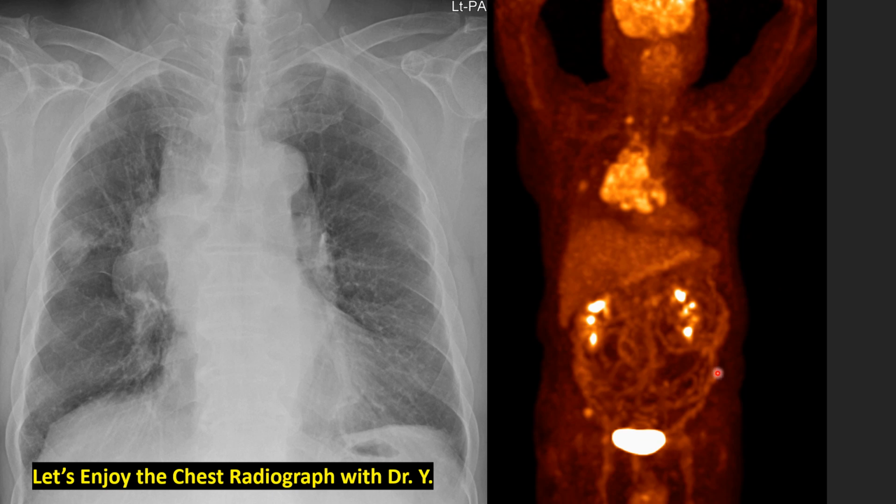How about this PET CT image? Solitary pulmonary nodule here, extensive, huge conglomerated mass here, supraclavicular lymph node. Are these all? One more. Pelvic metastasis. Usually, as I told you before, PET CT image shows more than CT image data. PET CT findings are usually, not always, more than the findings of CT.